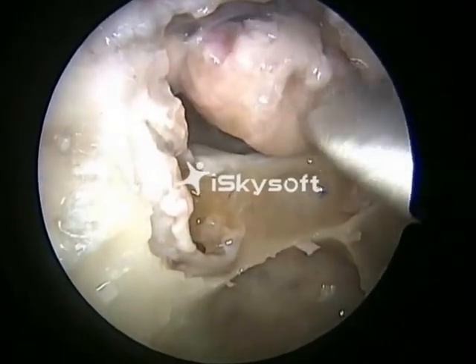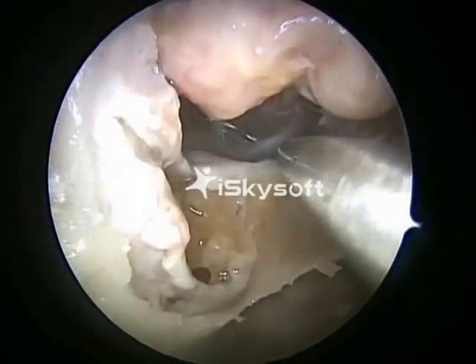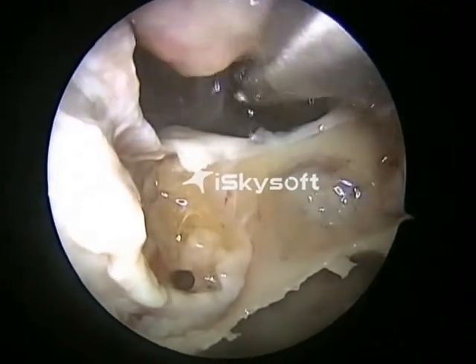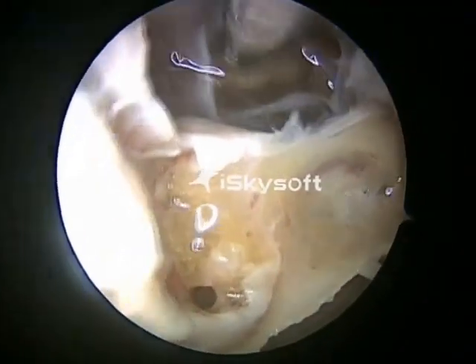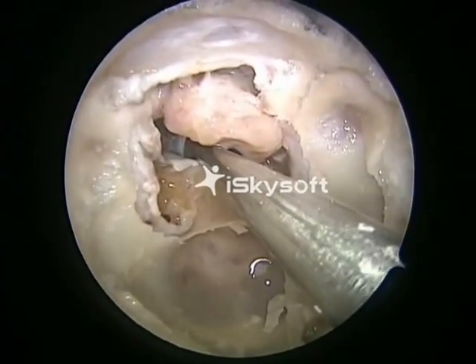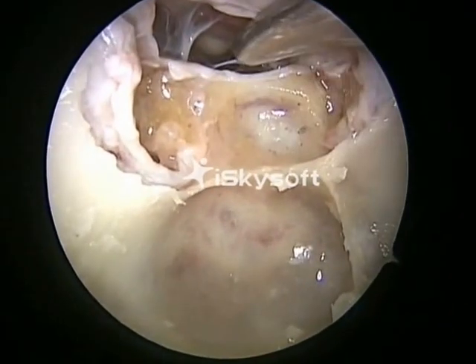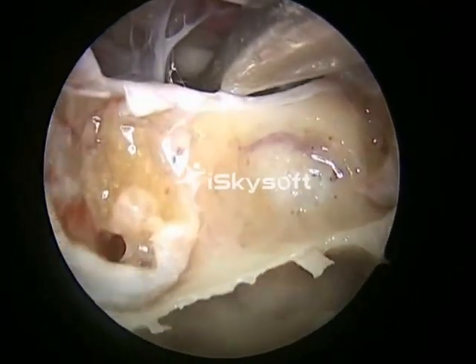Once the pituitary transposition is done, the gland is turned upwards, rotated upwards, and the view of the Liliequist membrane is obtained. Once that is perforated, we can get a view of the interpeduncular fossa, and the mammillary bodies can be seen very clearly there. Suction is being used to suck the CSF there. That's the mammillary bodies seen very nicely in the picture.